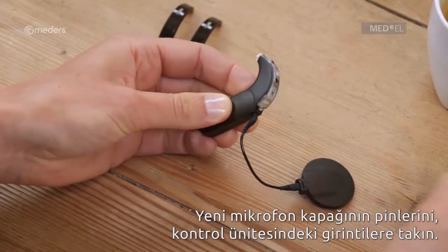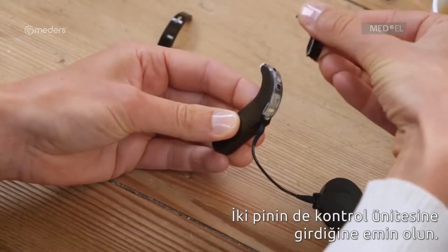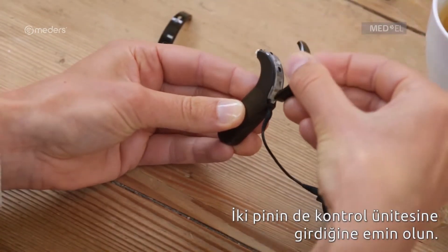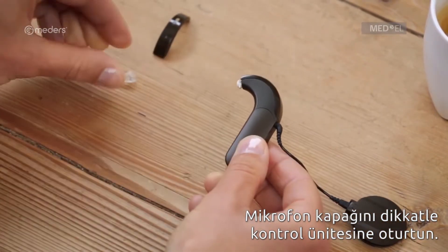Insert the pins of the new microphone cover into the recesses in the control unit. Make sure both pins are in the control unit. Carefully snap the microphone cover onto the control unit.